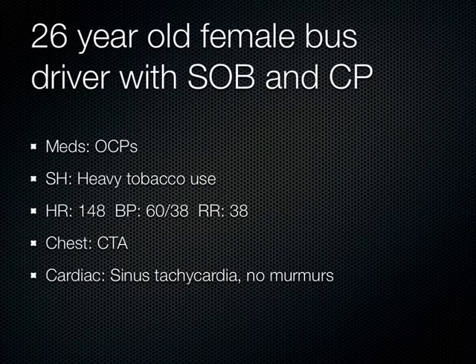Normally you've got the left ventricle and you've got the right ventricle. The right ventricle is about two-thirds the size of the left ventricle, correct? You with me? Yes. So what happens during a massive pulmonary embolism to cause this derangement of vital signs? The right heart gets bigger than the left heart.